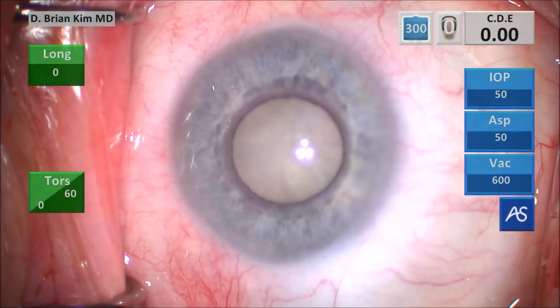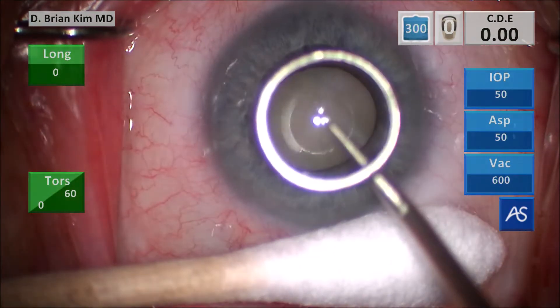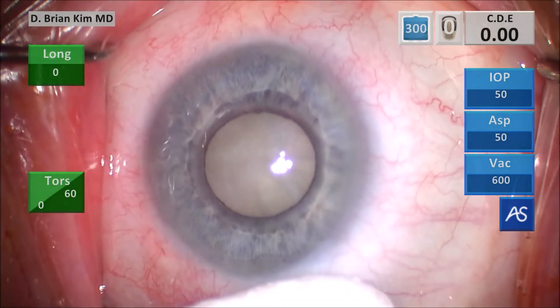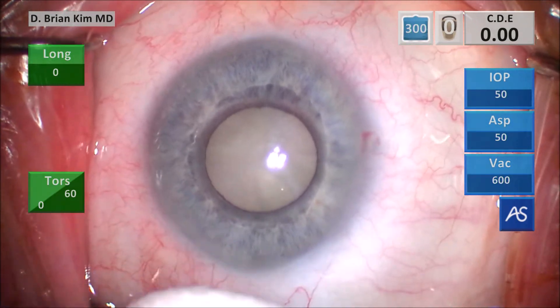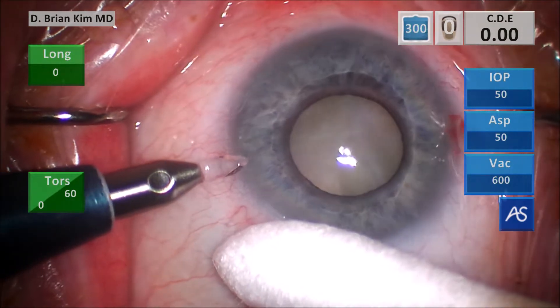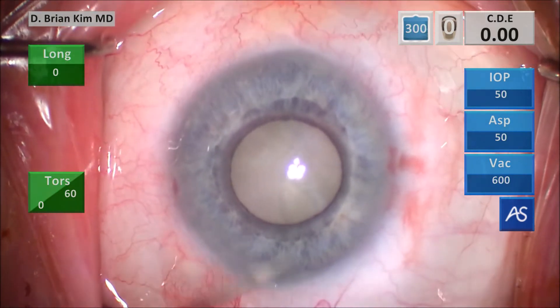This is the case — you can see this is a rather white and chalky cataract with quite a bit of density as well. I make my paracentesis incision first on the right side and then the left side, making sure I'm parallel to the iris plane, which creates a nice corneal shelf that will allow me to achieve a self-sealing incision.